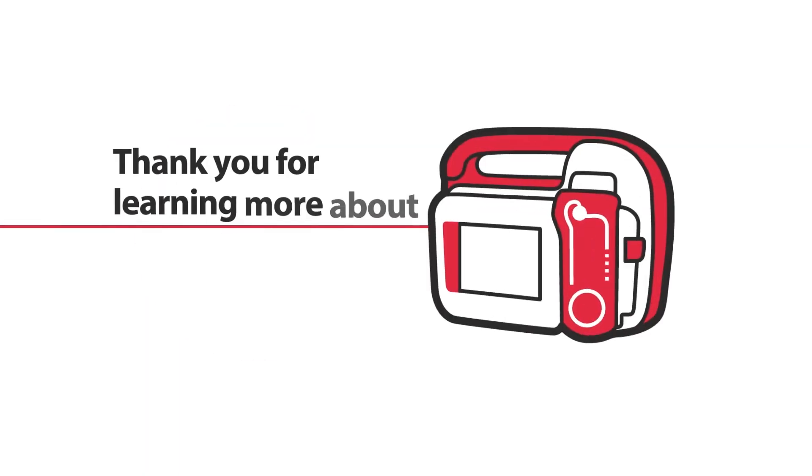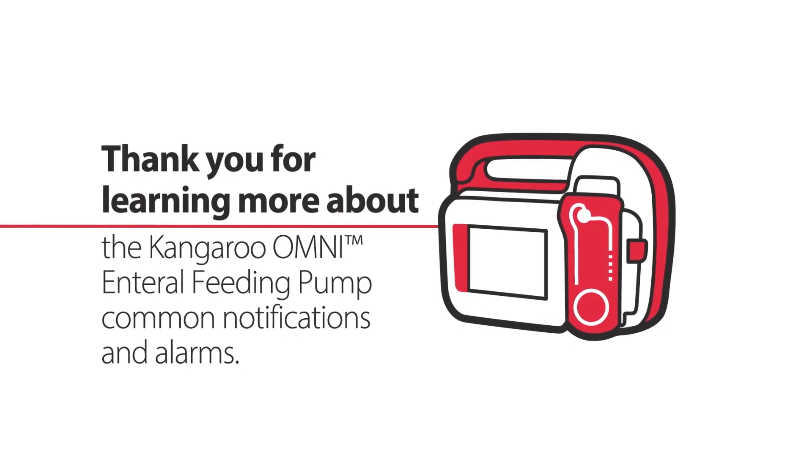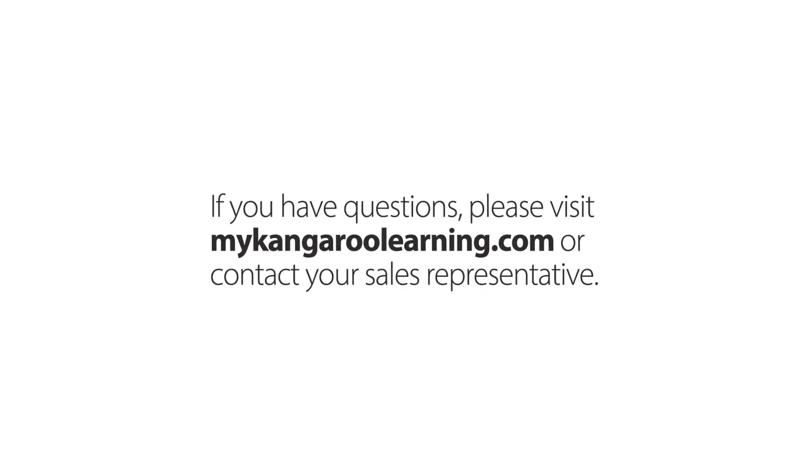Thank you for learning more about the Kangaroo Omni enteral feeding pump common notifications and alarms. If you have questions, please visit mykangaroolearning.com or contact your sales representative.